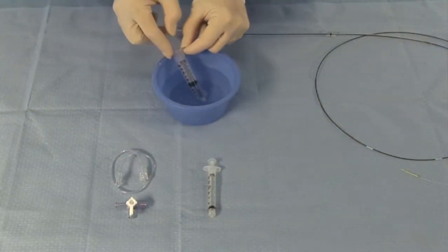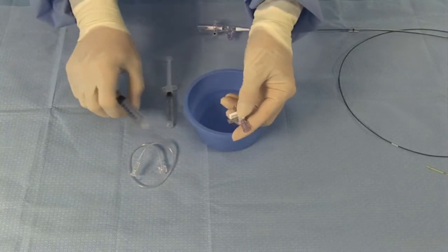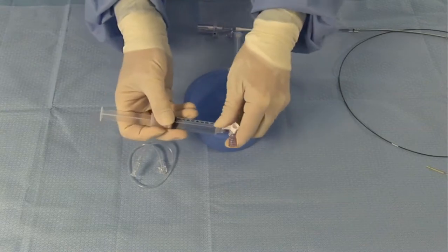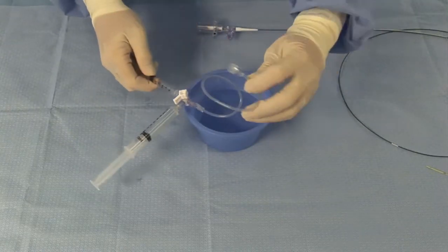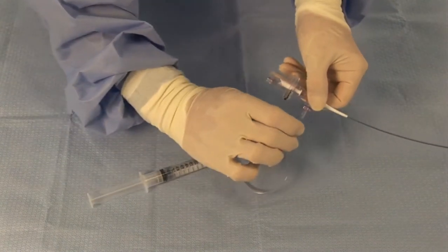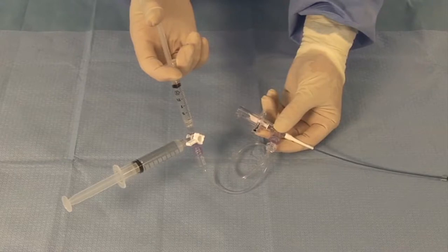Fill both the 10cc and 3cc syringes with sterile heparinized normal saline. Connect both syringes to the three-way stopcock and flush from one syringe into the other to expel any air within the stopcock. Then connect the assembly to the extension tube and use the 3cc syringe to flush the extension tube in order to expel all air from this assembly. Connect the extension tube to the one-way valve on the catheter hub. Flush the catheter continuously using the 3cc syringe until all bubbles are expressed from the clear distal shaft.